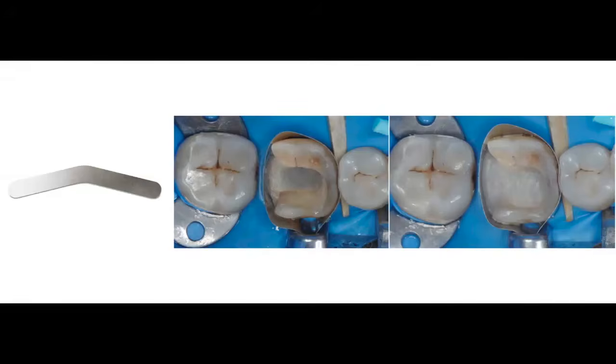Now, sometimes you're going to have to modify these bands. Let's say that this preparation that you're seeing is one of my cases. You can see how deep that mesial margin is. So in order for me to push this band more apically, I may need to cut a little horseshoe-shaped modification on the distal part of the band so that the band can sink more and then be pushed more towards the deep margin on the mesial.